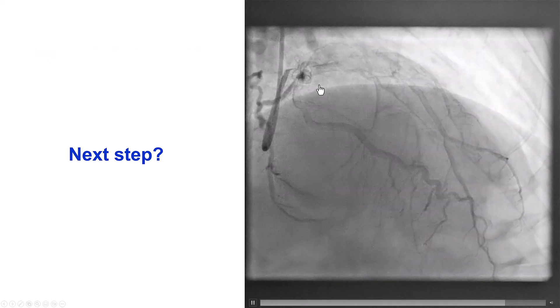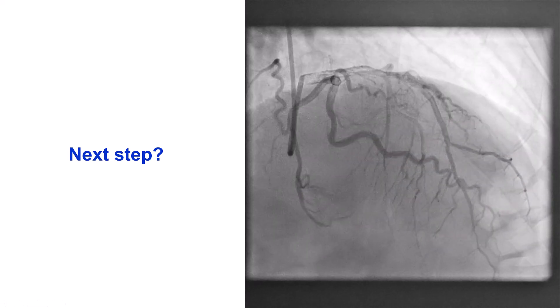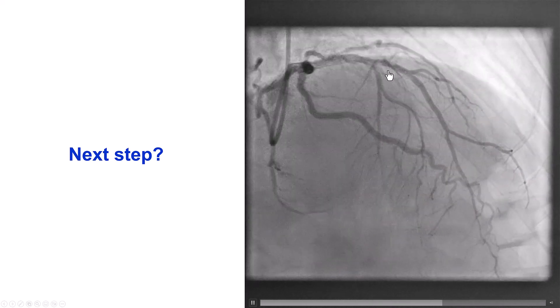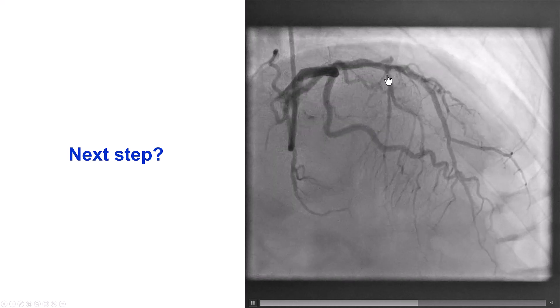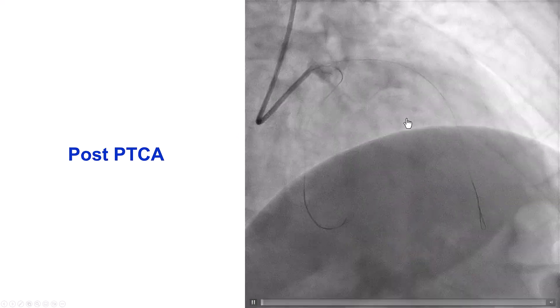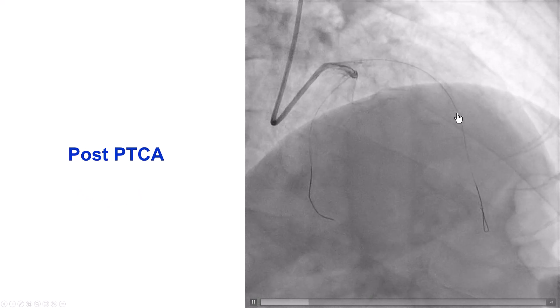Of note, the patient had not received P2Y12 inhibitors until the beginning of the percutaneous coronary intervention, which may be one of the reasons for these complications, which appear to represent acute stent thrombosis. When we have thrombus, options include more aggressive antiplatelet therapy with 2B3A inhibitors or cangrelor, thrombectomy, balloon angioplasty, and sometimes additional stenting. In this case, we gave cangrelor to allow the ticagrelor to take effect, then performed Penumbra thrombectomy followed by balloon angioplasty of the LAD.